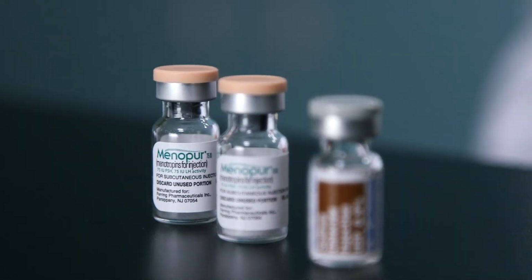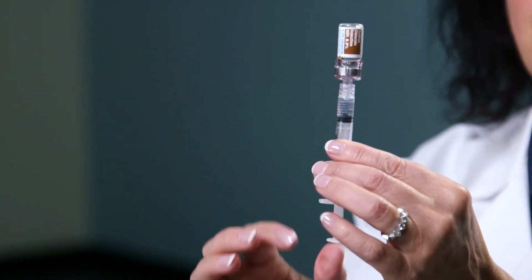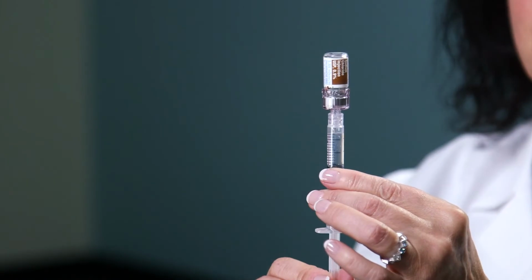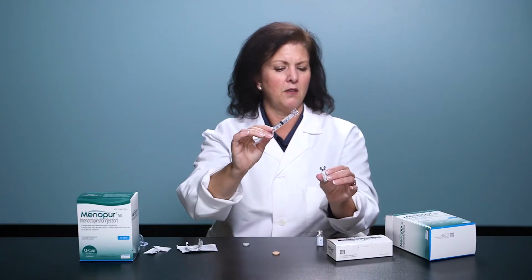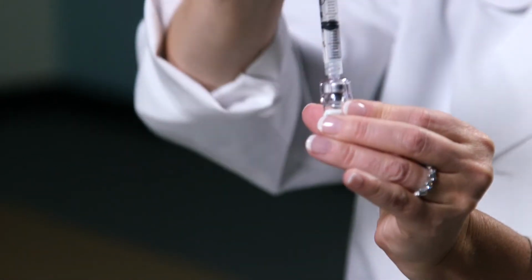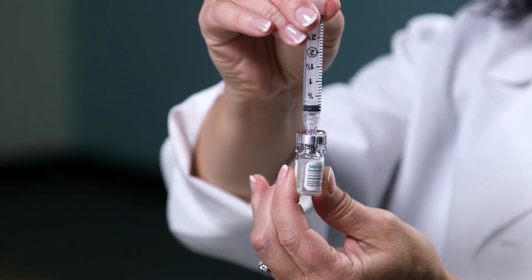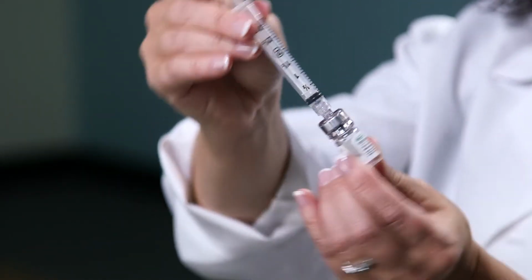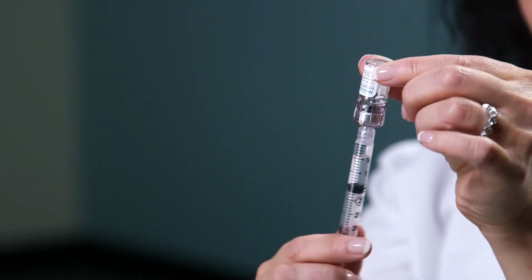If mixing more than 1 vial of Menopur, you'll draw up your usual 1 ml of the sodium chloride, and then take your Menopur vial and just snap the Q-cap on top of the Menopur vial. Press down on the plunger to expel the sodium chloride into the powder. Turn it around and draw it all back out.